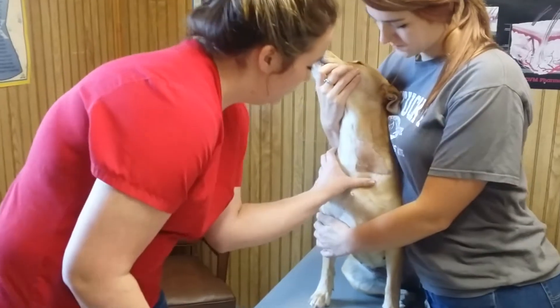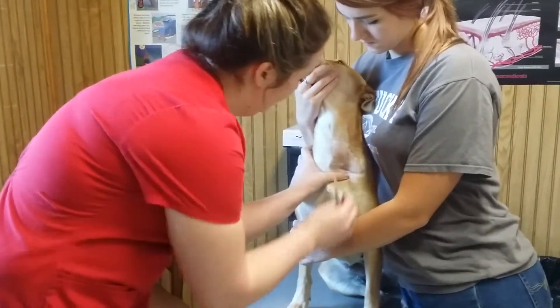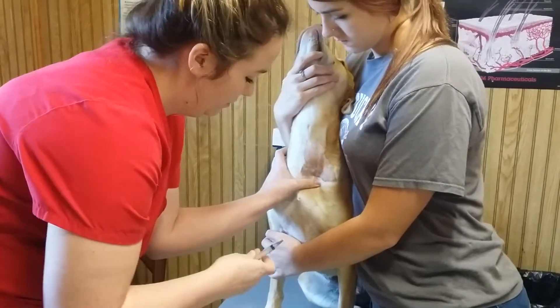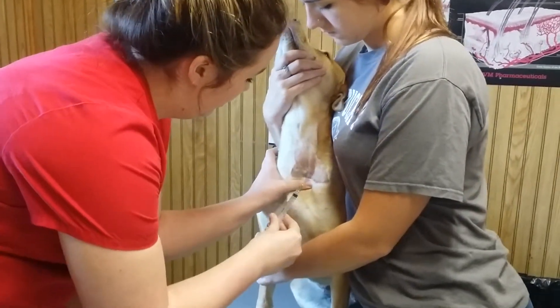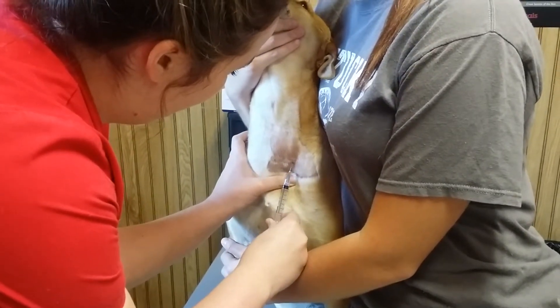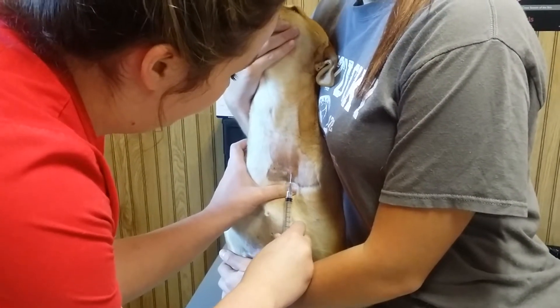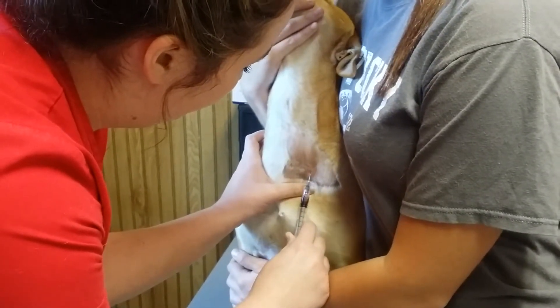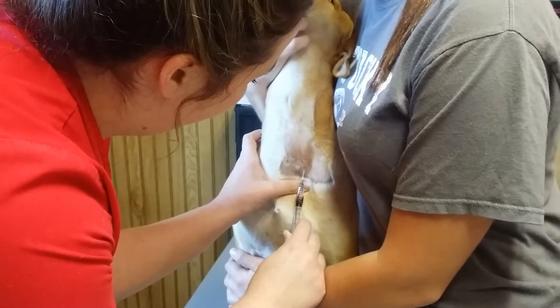First thing I'm going to do is locate the vein. I'm going to insert my needle, bevel up. And I have my thumb and forefinger, and I'm pulling back with my index finger.